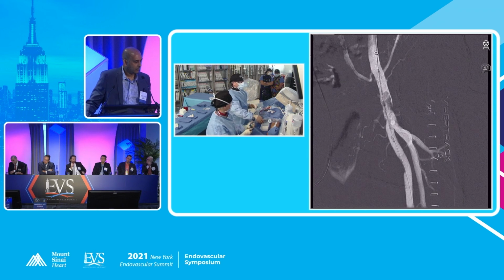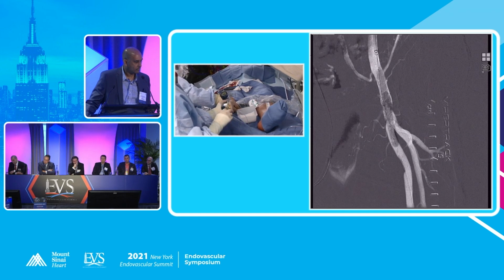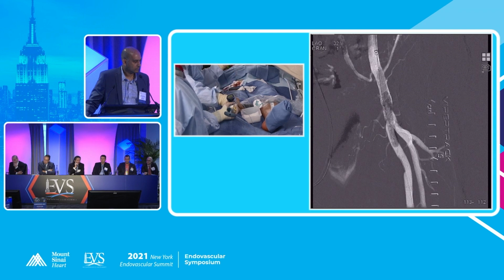And so what we're going to do in just a moment, folks, is see about the other Shockwave for below the knee. We did a balloon downstream already while the panel was opining, with a 2.5, just a regular balloon. But on our IVUS there was some calcium, so I think CSI or something was brought up, or if we already have Shockwave and we're paying for it and open it, we'll probably just use a Shockwave peripheral one as well.